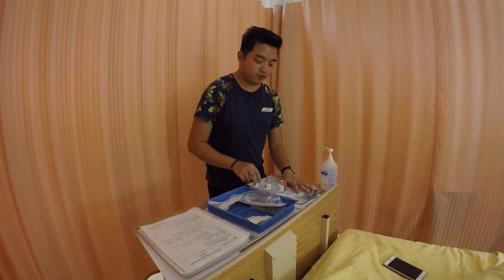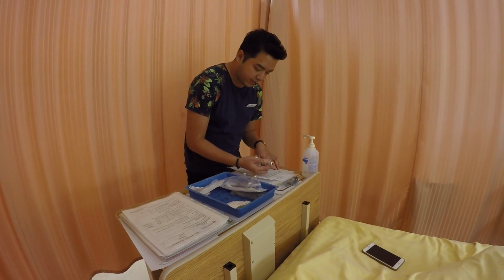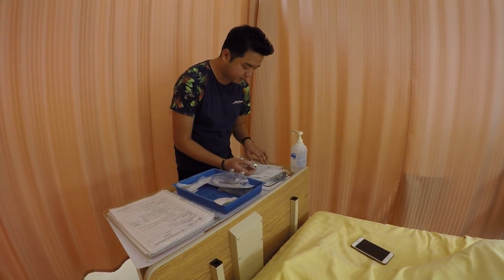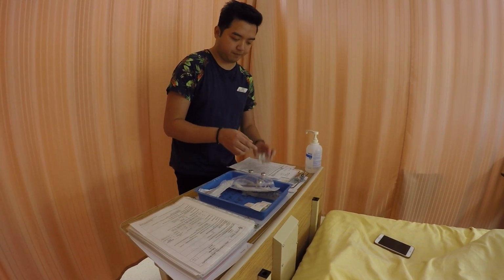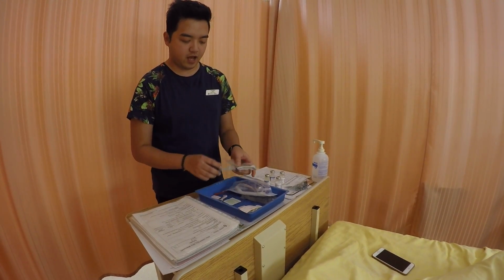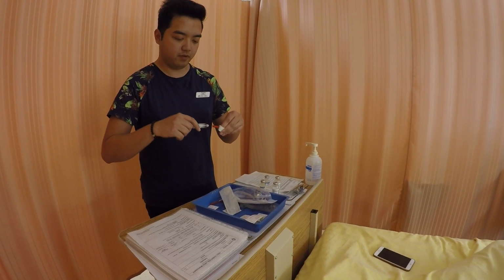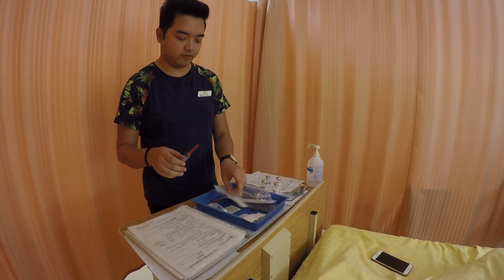I'm just going to do my second checks before preparing. Cefoxitin 1,500 milligrams for Mrs. De La Cruz, IV, every 8 hours, and the time is now. Okay, and now I'm ready to prepare. First I need a 10 ml syringe and a blunt needle. Make sure that the ends are still sterile, and just remove that one.